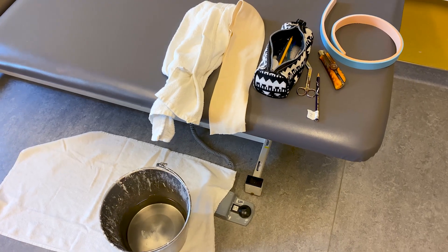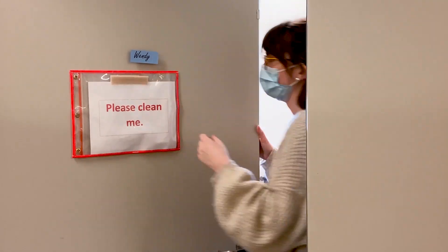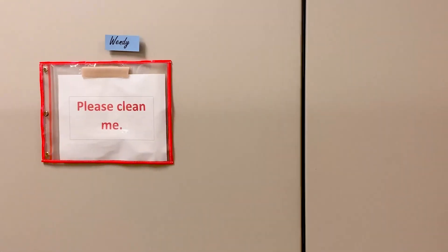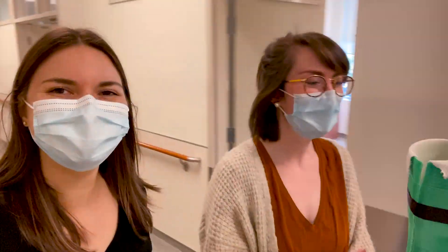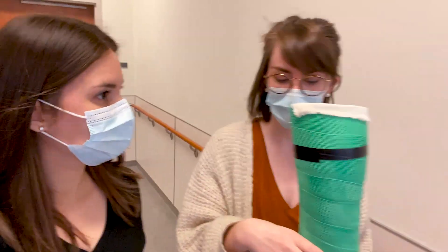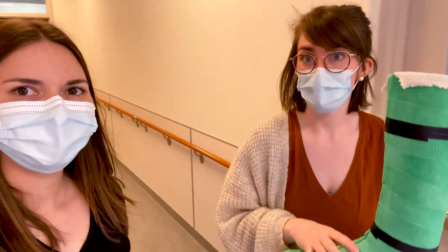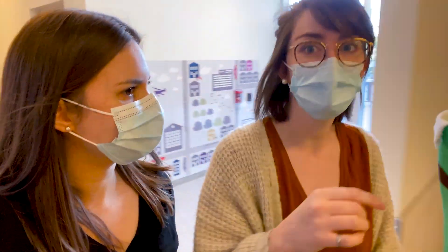Now we're all set up. I'm going to go get her and take a cast. It looks fantastic — the inside has the stockinette and the outside is the scotch cast. We got a really good shape capture and I'm going to take this into our modifying room where it'll get filled with plaster and then I'll modify it.